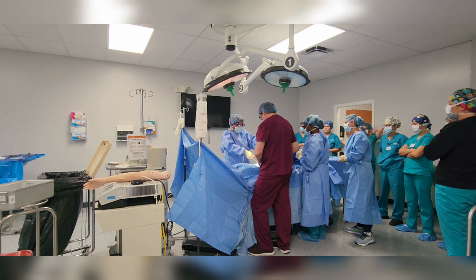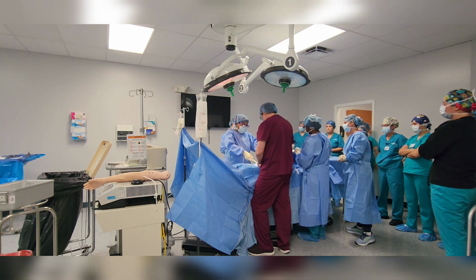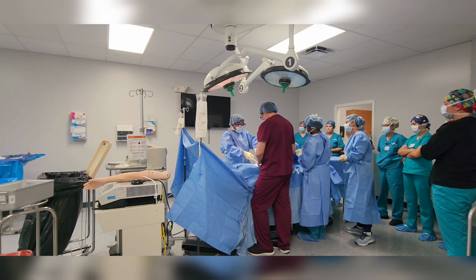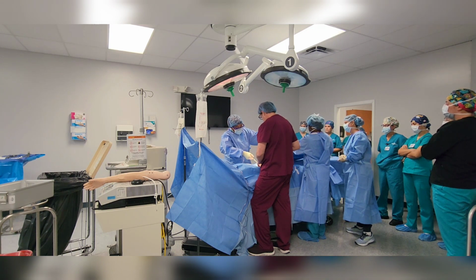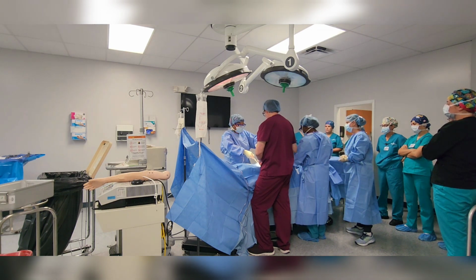Good. Take that off. Good. Can I get a sponge forcep? Take that off. Can I get an Alice? All right, we'll stop. Take all those off.